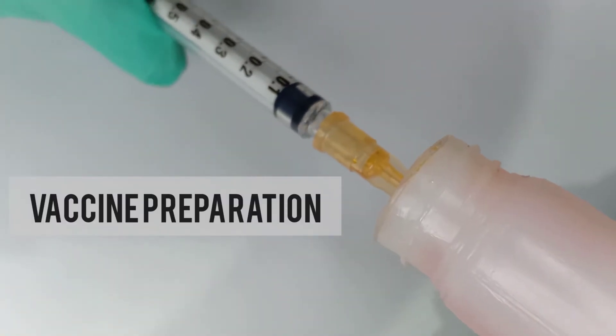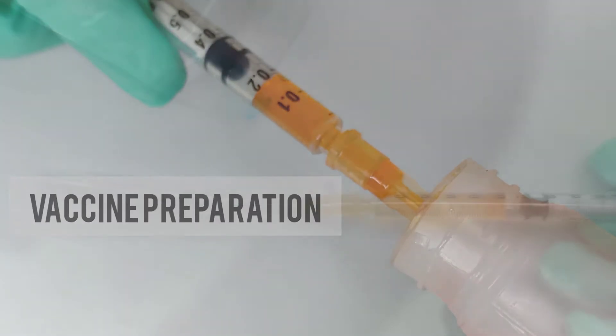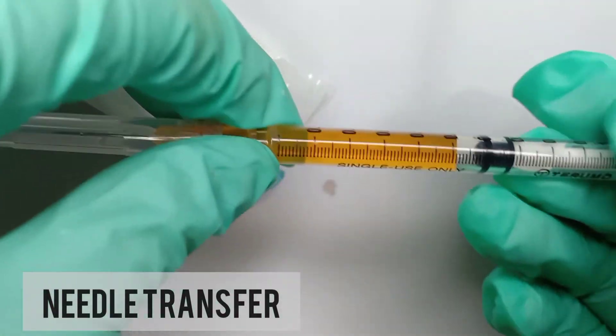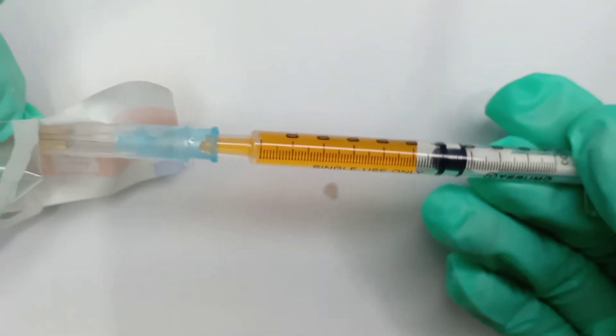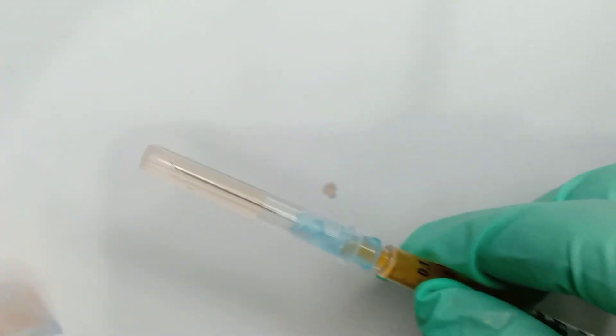Draw up 0.5 ml of vaccine in a slanting position where the vaccine is slightly higher than the needle. Close the needle with its cover, detach it, and attach a 23 to 25 gauge needle to the syringe. Make sure that it is intact and firm.